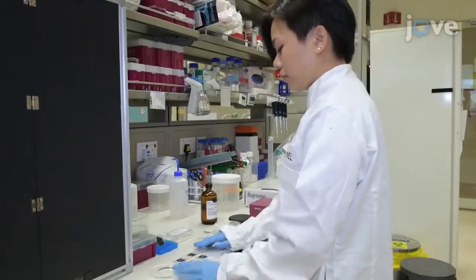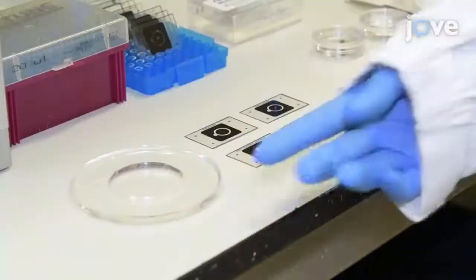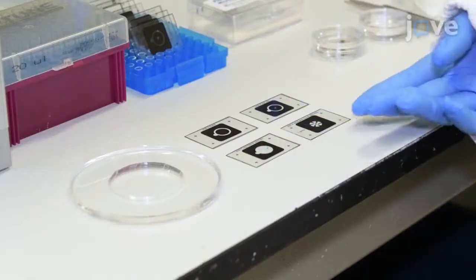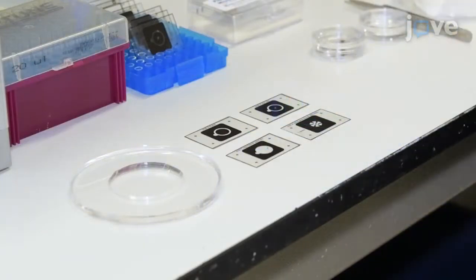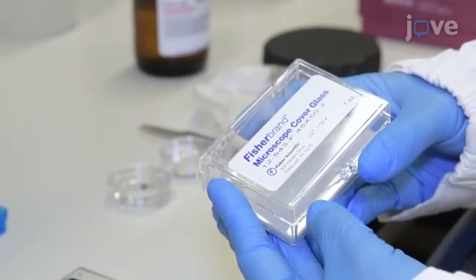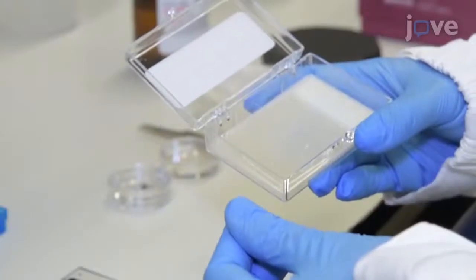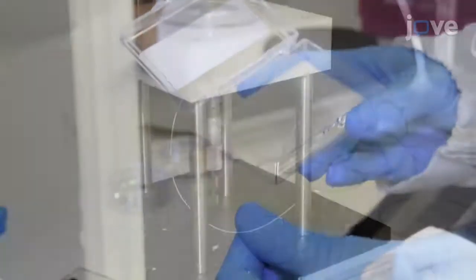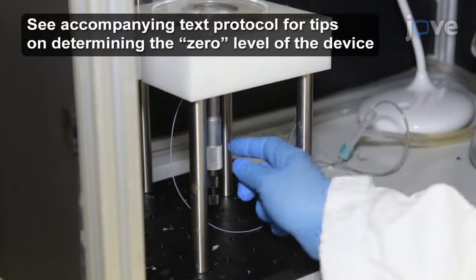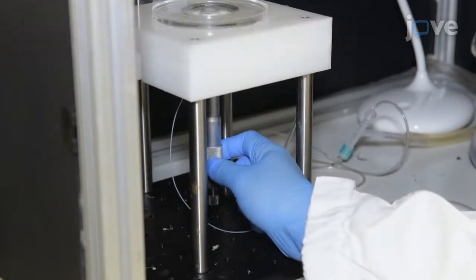To begin, review the accompanying text protocol and use it to fabricate the PDMS chamber and design the photomasks as described in the accompanying text protocol. Next, create the top lid for the PDMS chamber using an untreated piece of a No. 2 glass cover slip. Starting from the 0 level of the device, lower the bottom substrate using the micrometer head to the desired height.